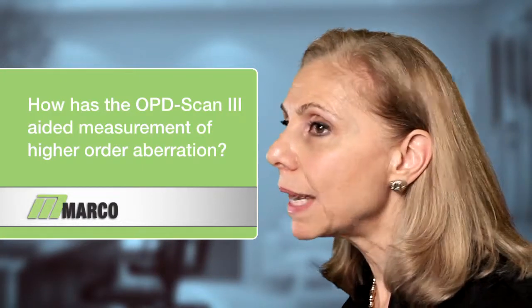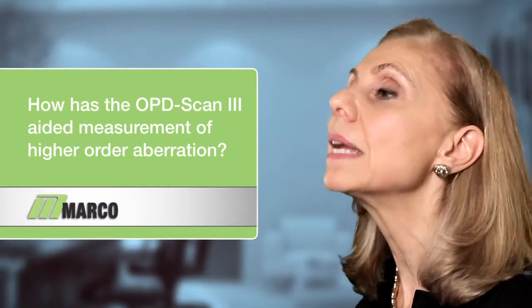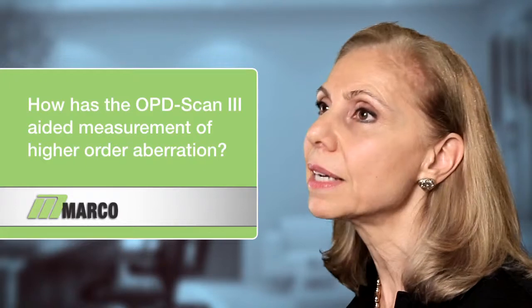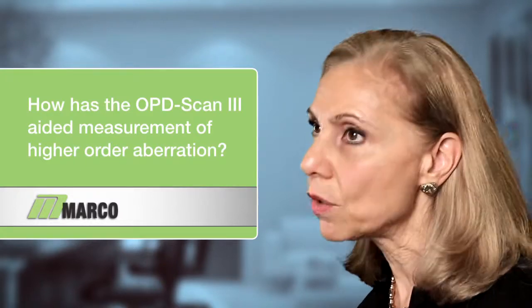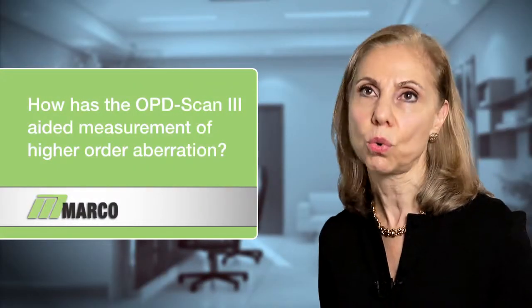So by explaining this to them ahead, to both the patient and his or her family, they now know that even after cataract surgery, they can expect a little bit of feathering or glare or halos, however one wants to explain it, towards a point source of light.